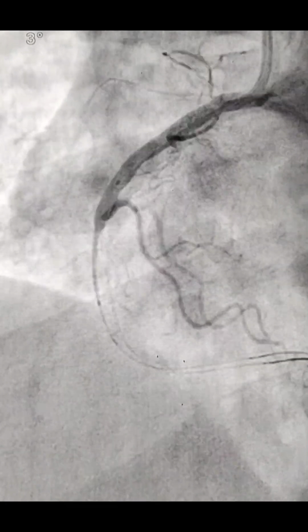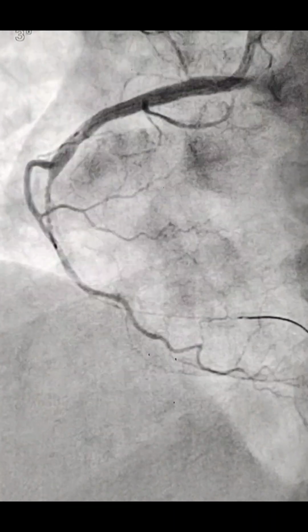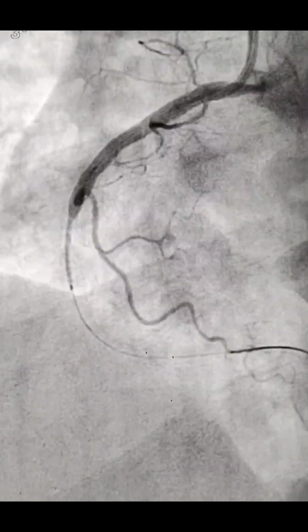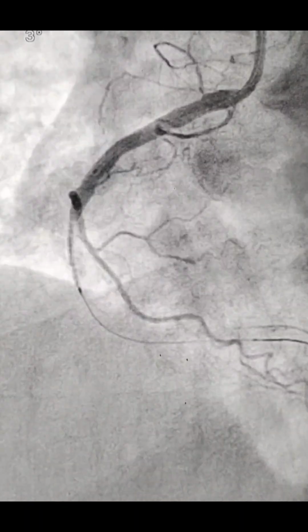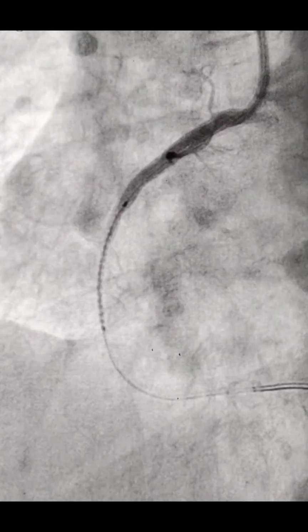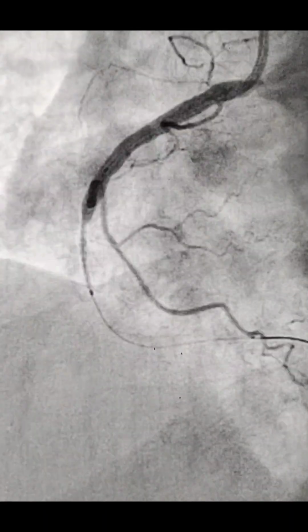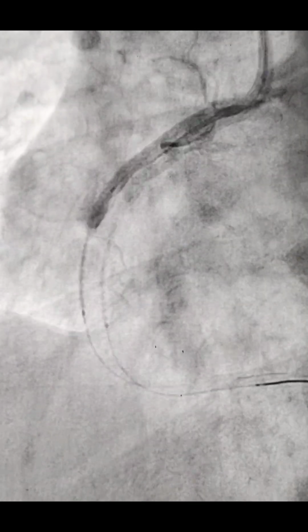So this is the placement of the stent. After placing the stent, my fear was that this RV branch should not get closed, because I wanted to put a stent across this branch. But in such a large artery, a 3.5 artery, you won't get side branch occlusion while putting a stent. So I decided to put this 3.5 stent in 24.